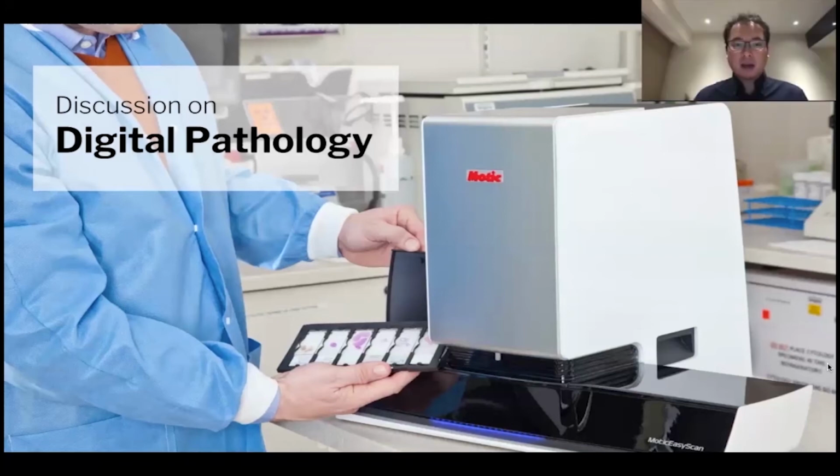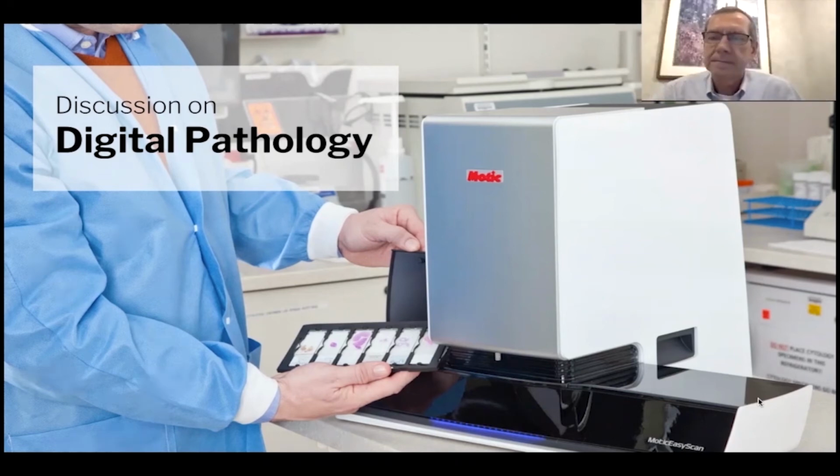Great. Thank you. I know that many of our viewers would be interested in knowing how the implementation was like for you, because as you know, anytime a hospital onboards new technology, outside the validation, you have to learn the technology and you have to integrate it into your routine processes every day. What was the learning curve like for your institution when you implemented this product, and how does the whole process look today in routine use?